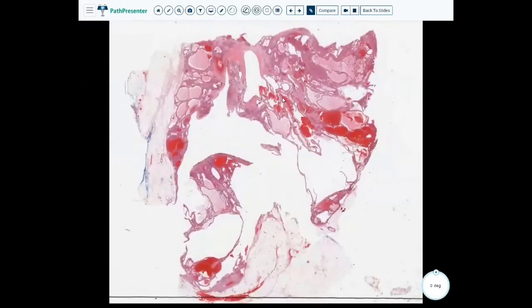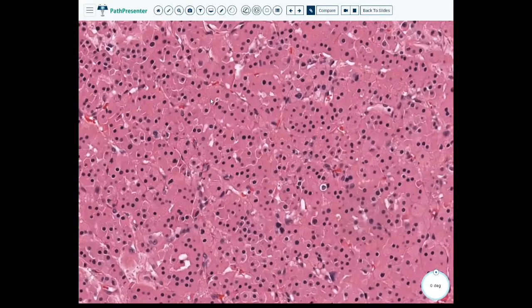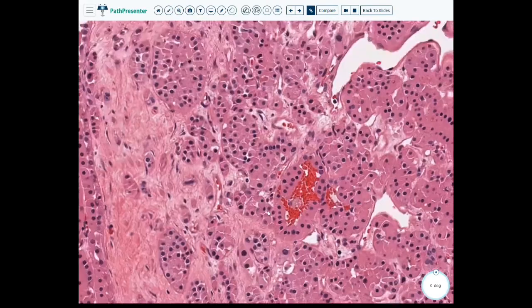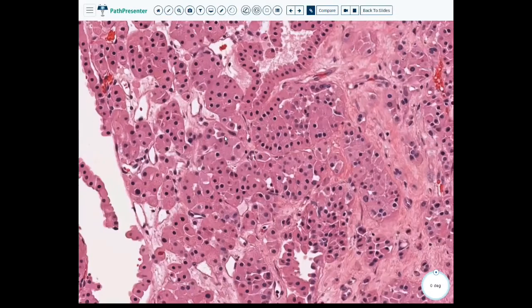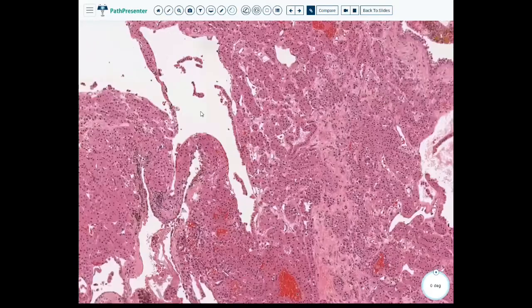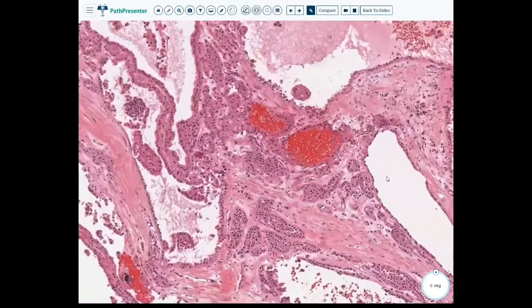Case 11. So if we thought the previous case didn't give us much, this looks like even less, maybe. We have lots of fat. Again, this all looks lesional. Nothing here that looks normal, and very cystic, very pink. And again, we are met with our oncocytic background. That cell's a little bigger. So hopefully at this point, everyone is happy with saying that that's oncocytic. And let's go to an area that definitely we can tell is cystic. Okay, so either of these, I guess.